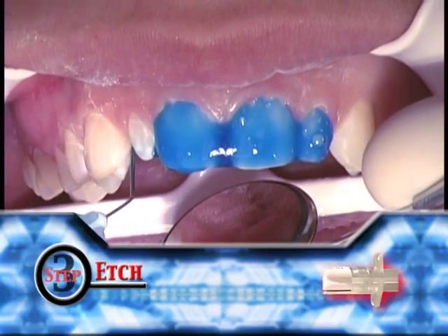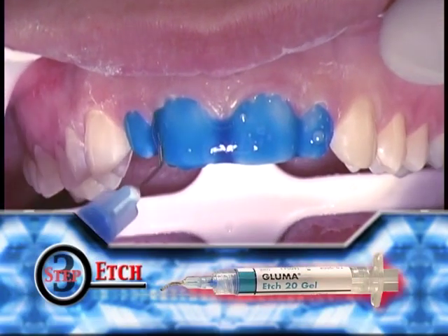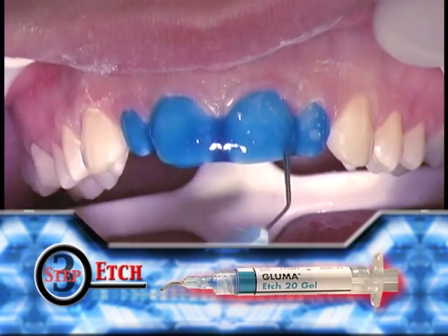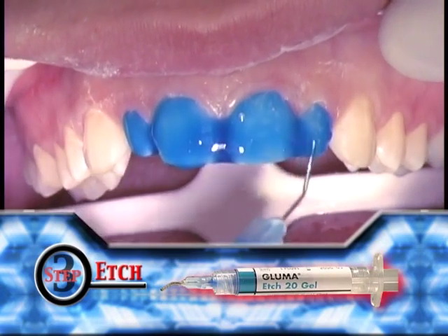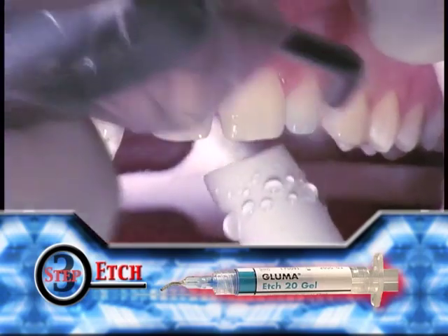Next, the Gluma etching gel is applied. Because the dentin is not exposed, over-etching of the dentin is not likely. Therefore, the 15 to 20 second maximum limit to etching can be exceeded. Finish by rinsing and air drying only.